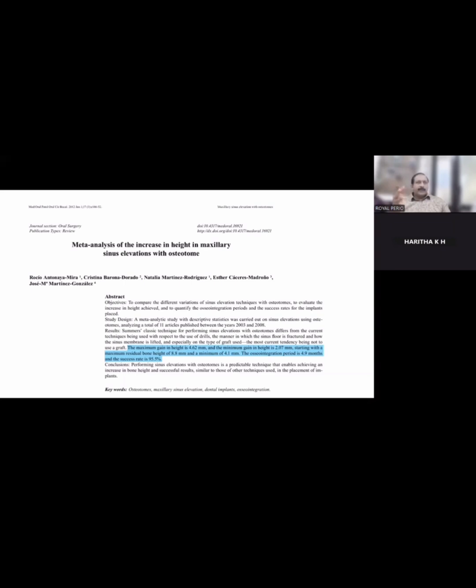From your measurements, what was seen is the floor is at 8 millimeter, or it could be 1 millimeter less, consider it as 7. So you need to go in for plus 3 millimeter. Plus 3 means 10, so you want to go in for a 10 millimeter long implant. It is suggestive that if everything is okay, you can still raise it by 4 to 4.6. So consider both implants, 4.25 into 8 and 4.25 into 10. You should have both sizes of implants with you.